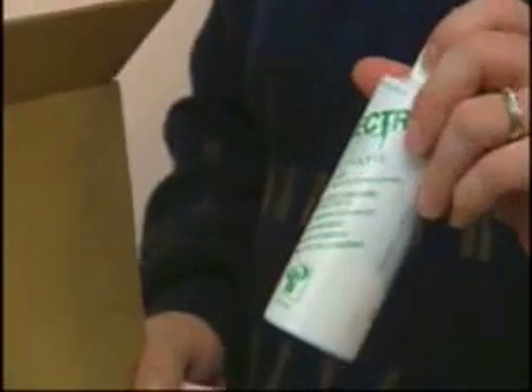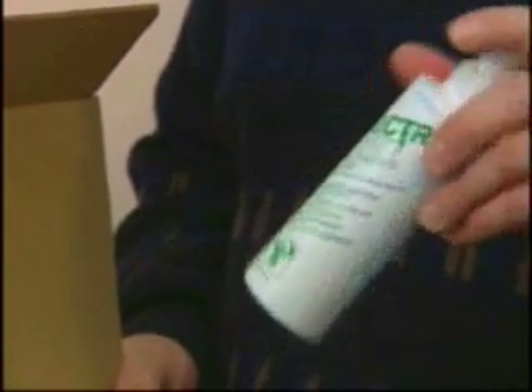And a bottle of ElectroMist, which is the commercial electrode solution that we use with flex-trodes.